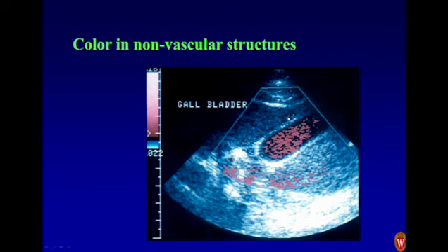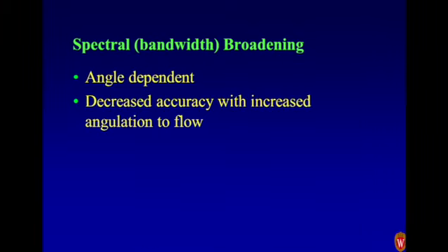It's my gallbladder. The only thing I was doing here was taking the transducer and moving it in and out, pushing against everything. And so at a point in this image, everything was moving. And look where the system painted the color. It painted only where the low intensity reflectors are. So if you're taking an image of a cyst and you're ready to hit the freeze button and the patient blows their breath out, and just as you freeze it, the color paints into that cyst, don't take the picture. Again, you don't have to explain this artifact.